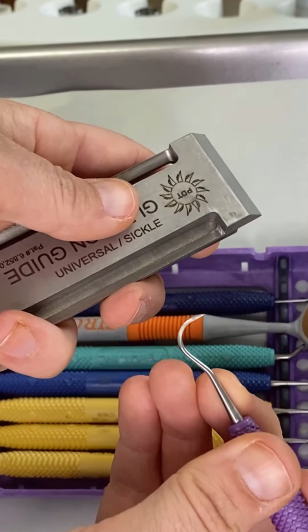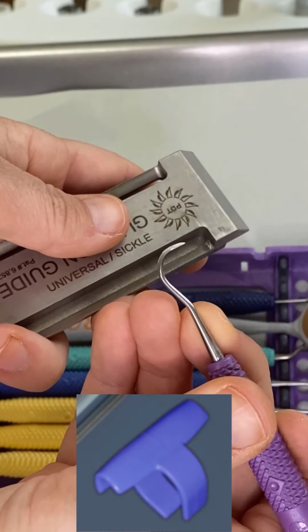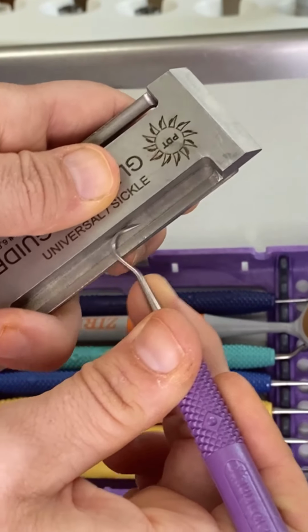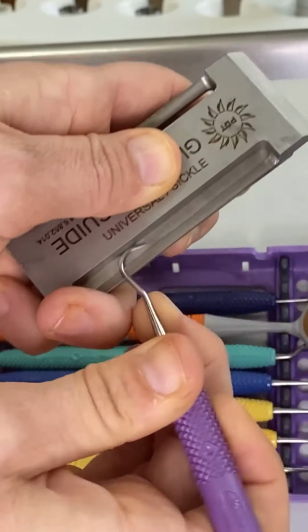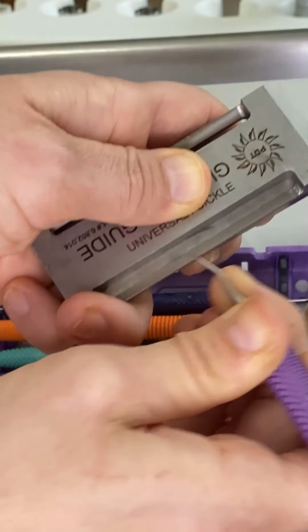And then I would flip it. I use a ping ring, which I do not have out with me right now, but I also use the light to just make sure that my cutting edges aren't all crazy. And then I'll flip it. And again, I'm fast at this now, but it took some time to get to that.